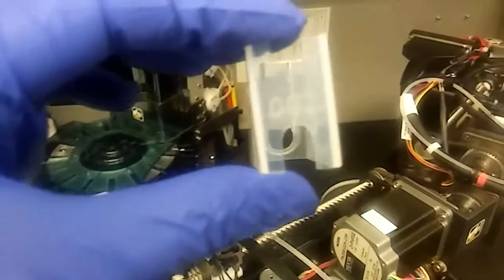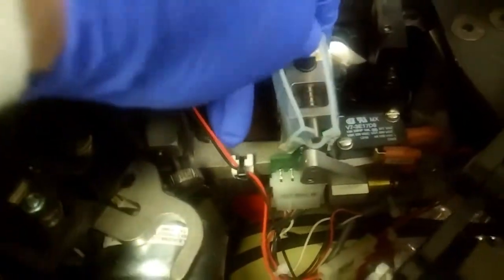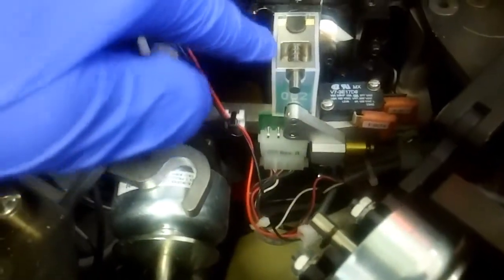Place the new diaphragm with the numbers facing in the right direction — this side towards the front and this over the back. That little hole has to fit around a little knob. Push that button in and get it over the top part. Make sure you push it down snug so that none of it is above the metal rim. Keep pushing it down and make sure it's fit around that bottom circle, otherwise you'll get a hissing noise.